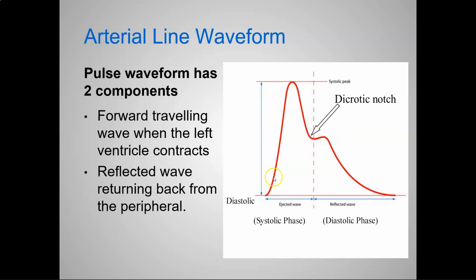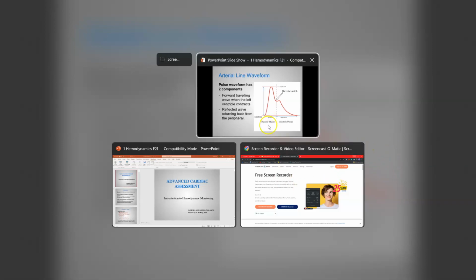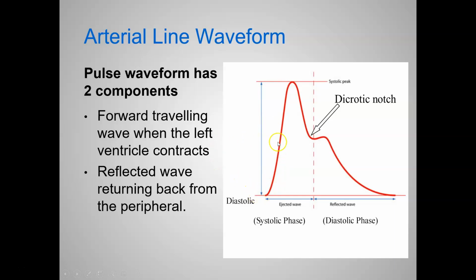That's why you see peak pressure, peak work. Then, I'm going to relax, refill, and do it again. So up, peak pressure, coming down, relaxing, refilling, and spike again. This is how it should look.